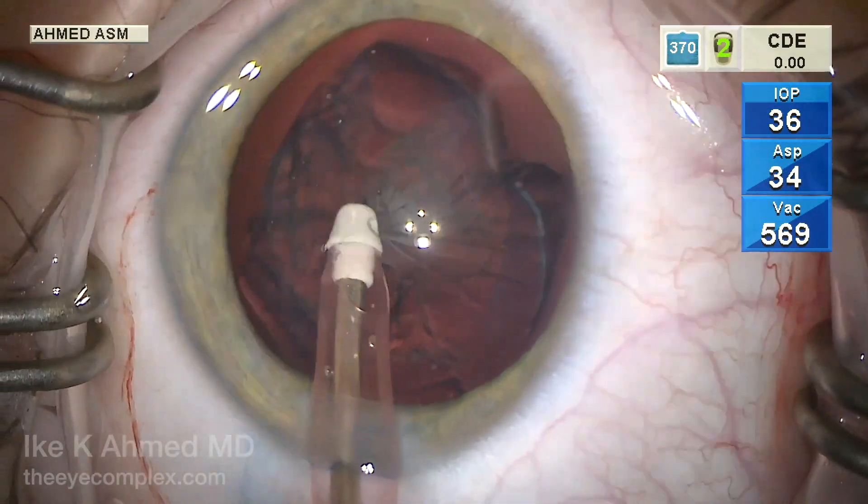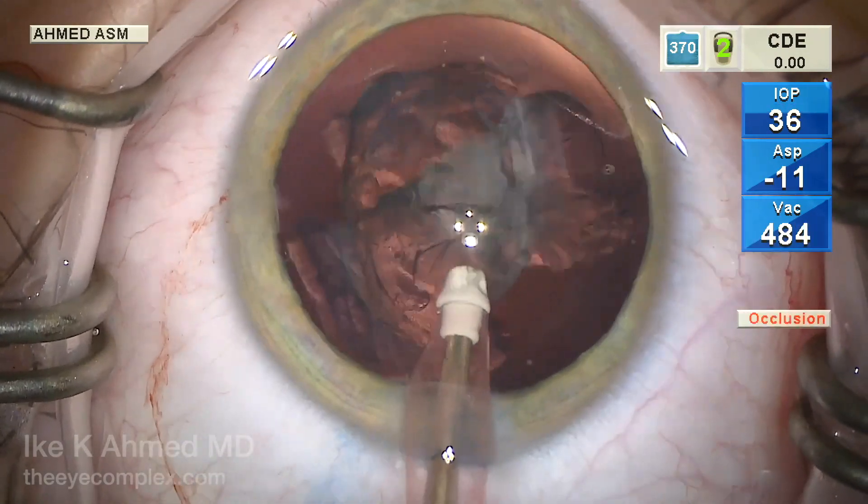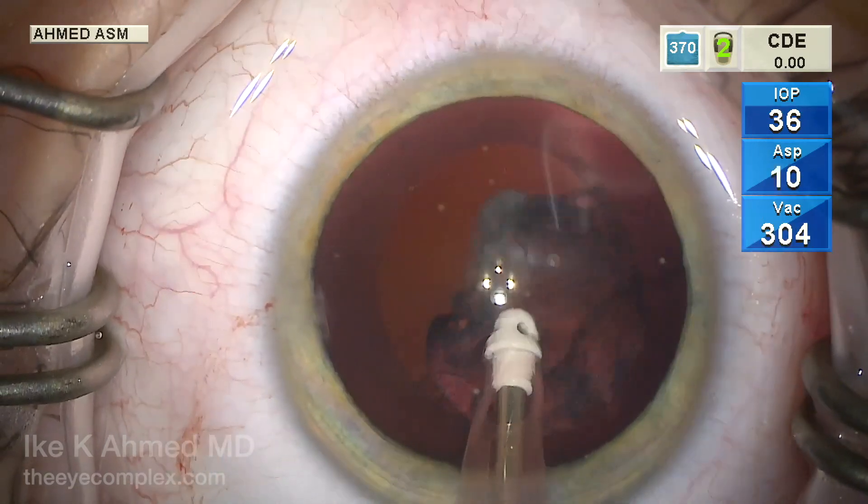Here we're using the IA with the polymer tip to remove the cortical material and the central nucleus. It's very soft, of course, and is removed quite efficiently.